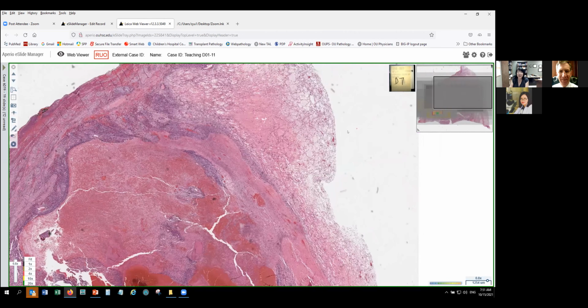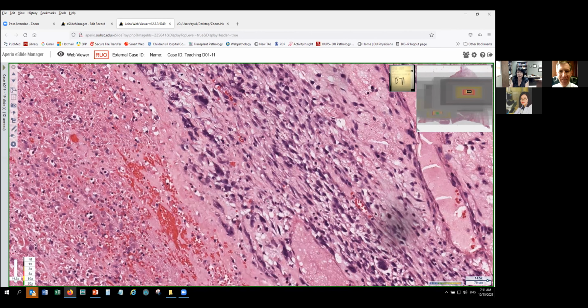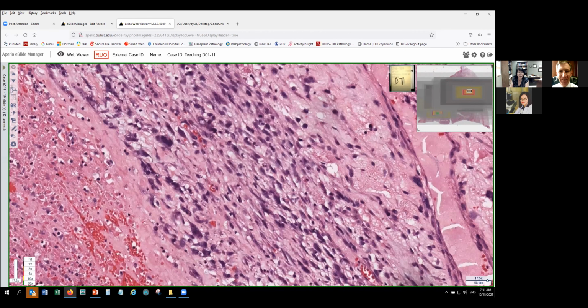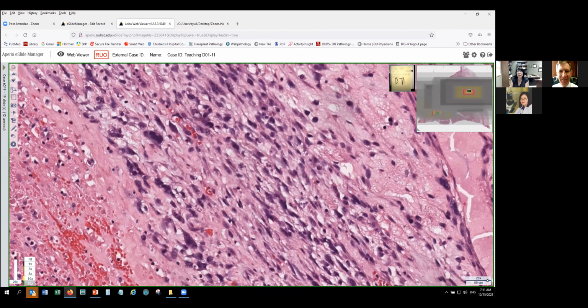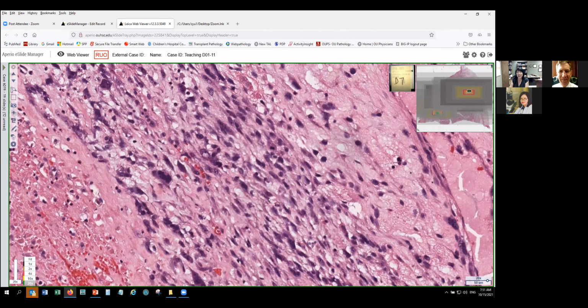That's like an edema. And this area also has spindle cells, very pleomorphic, in the liver. So it's not a hepatocellular carcinoma. It's not hepatoblastoma. Looks more like a mesenchymal tumor. With this kind of morphology, the differential could be embryonal rhabdomyosarcoma or another entity called undifferentiated embryonal sarcoma. It's not a carcinoma, it's a sarcoma.